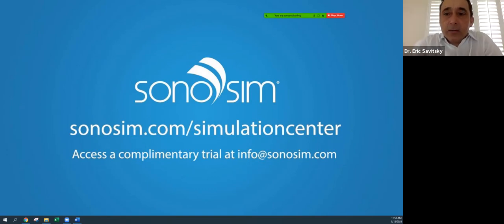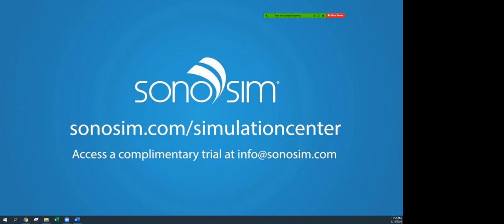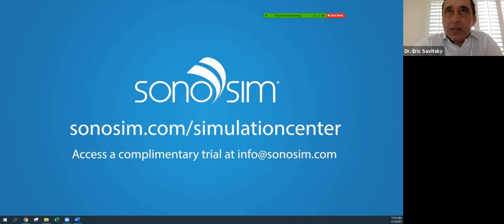Yeah. So how does that relate to the blue pad that you showed at the beginning of the video? How do those two different things relate? Yeah, I can just jump in there. It's a great question. So there's the scan pad where there's an individual user. And that's just basically a kind of a home base that allows someone to rest the probe. And then there's the SonoSim tags, which you apply to either a person or a mannequin. Were you alluding to the tags themselves as part of SonoSim Live Scan, or was it the scan pad question that you had?